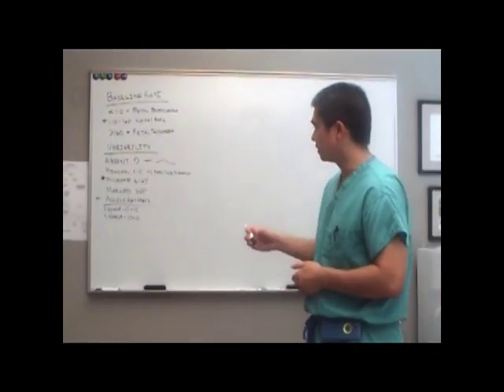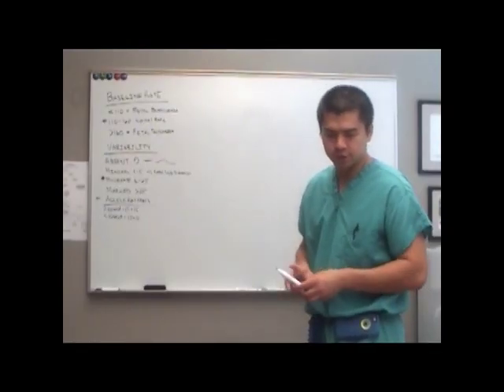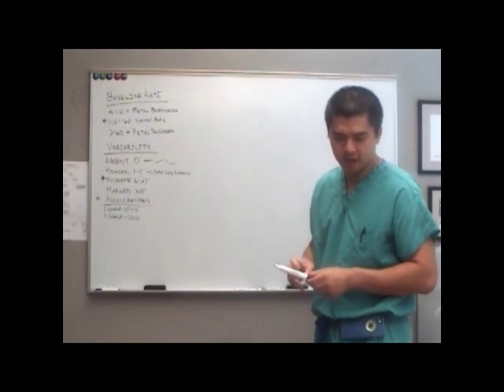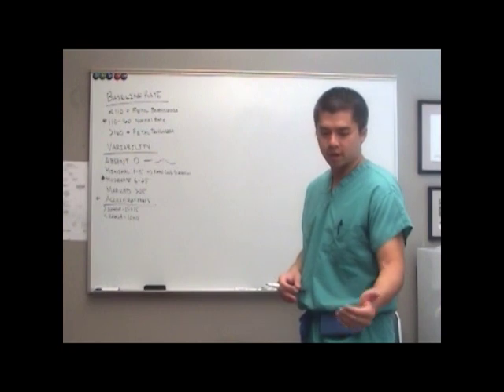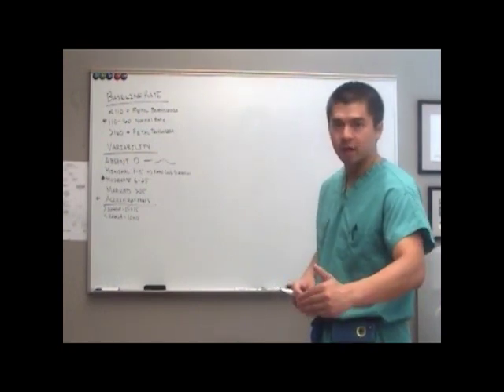Now, again, it's 15 by 15 for greater than 32 weeks gestational age, which is a box and a half by a box and a half. And so when you're looking at the screen real quick, you can tell, okay, I definitely have a box and a half by a box and a half rise.